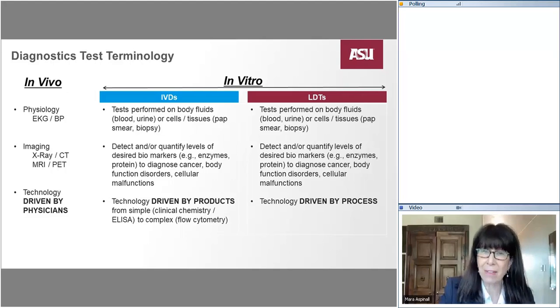But what about LDTs? A lot of similarities. Number one, same sort of bodily fluids. Number two, same sort of biomarkers that we're looking for, enzymes, proteins, or otherwise. But the key here is the technology is driven by the process itself, not by the products or the tests. So let's break that down further.